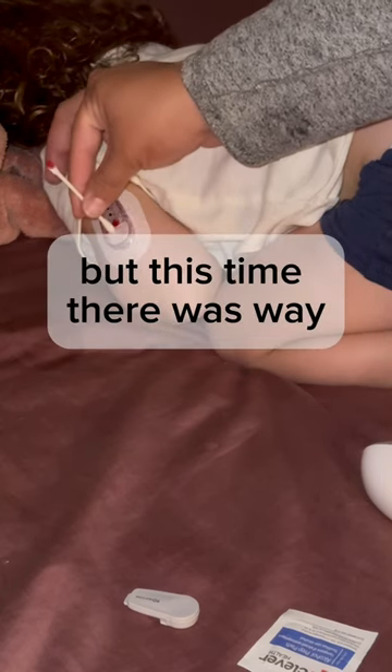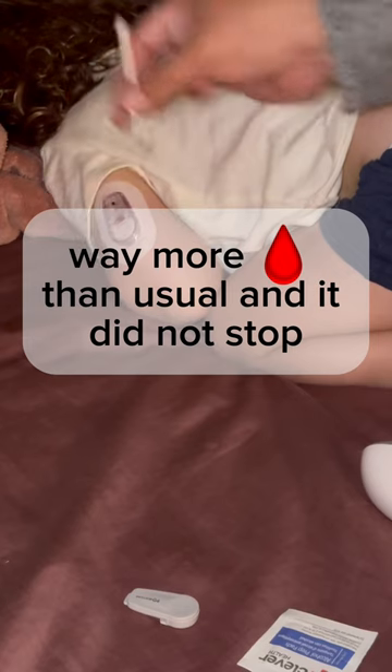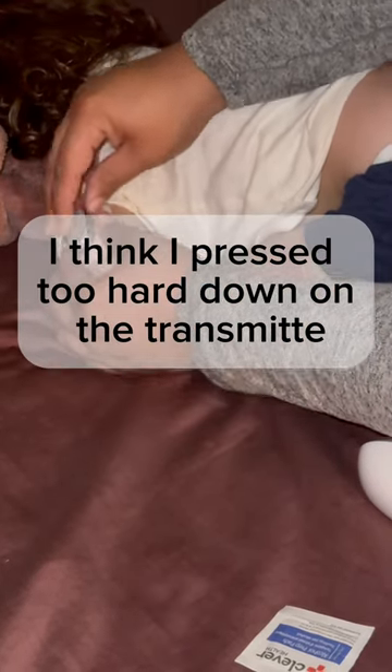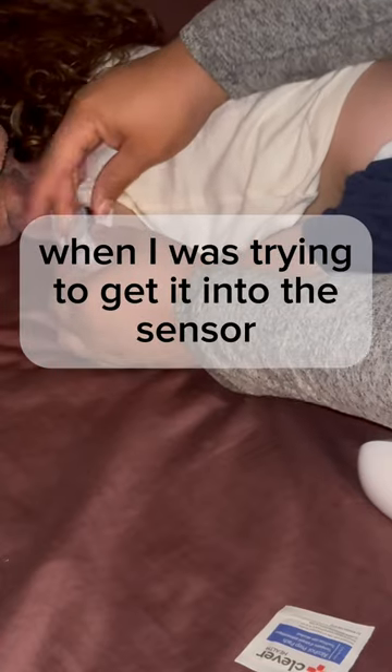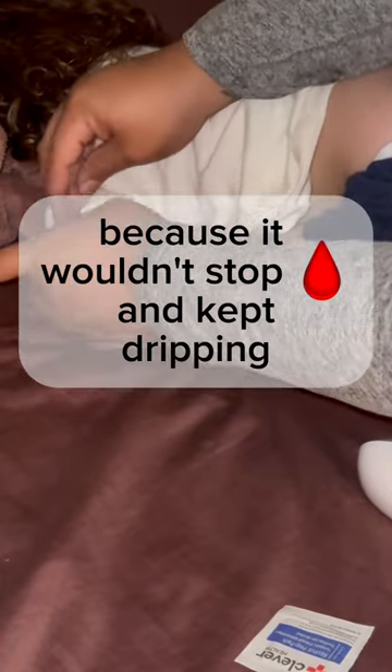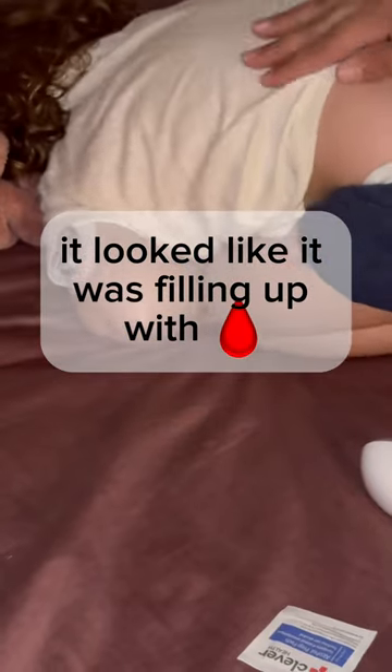But this time there was way way more blood than usual and it did not stop. I think I pressed too hard down on the transmitter when I was trying to get it into the sensor, and I think I made it a little worse because it wouldn't stop bleeding. It kept dripping and it looked like it was filling up with blood.